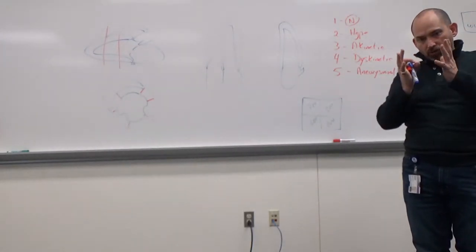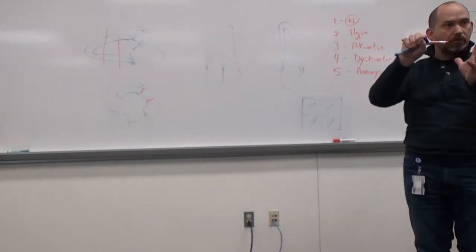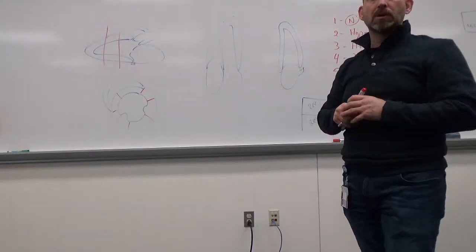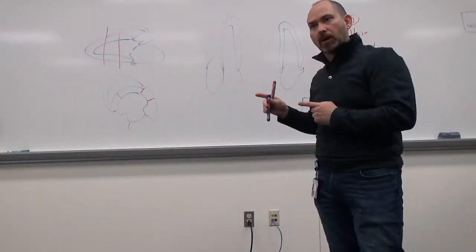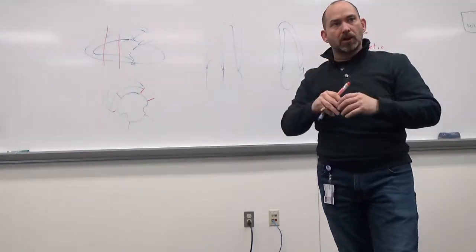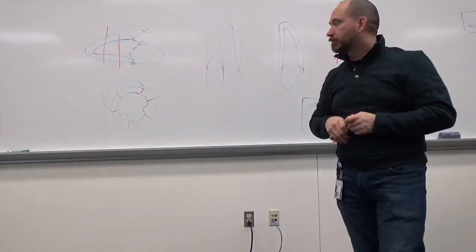So you're watching through the wall, you're watching where the filling comes, and then you're going to see an absence of fill. So it's going to be a dark area around that's not showing fill. If we're doing perfusion echocardiography, you're going to see an absence of filling in that area, at least for a little bit. Okay, it might eventually get there if you wait too long.